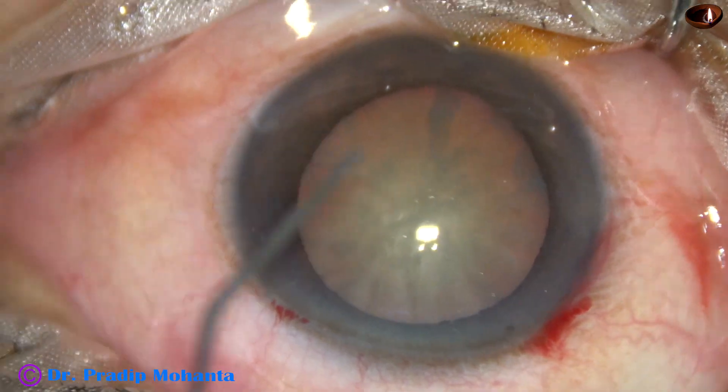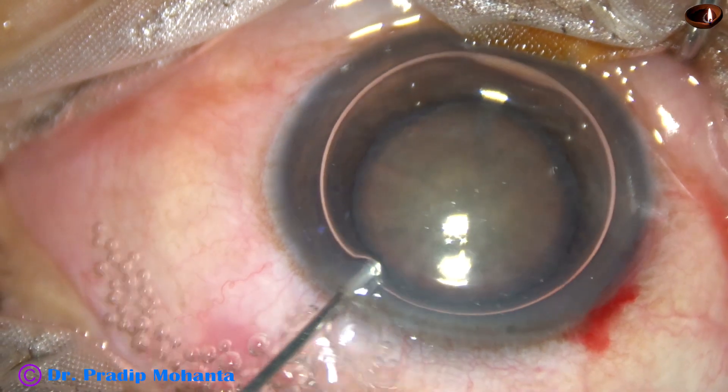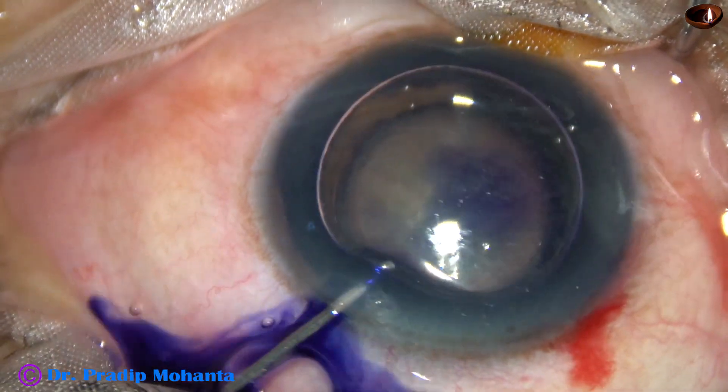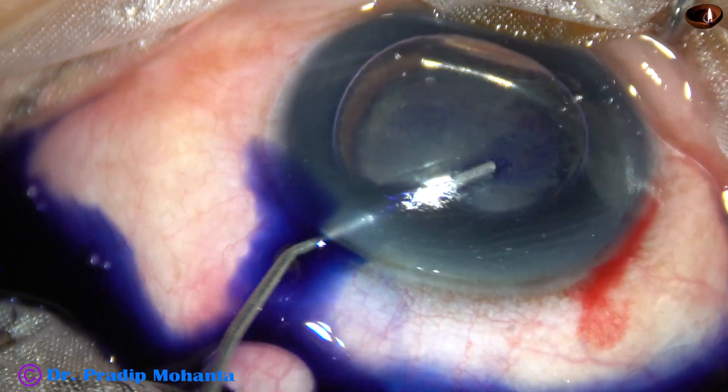An air bubble is injected to fill the anterior chamber. Then Trypan Blue 0.06% dye is applied underneath this air bubble over the anterior lens capsule.